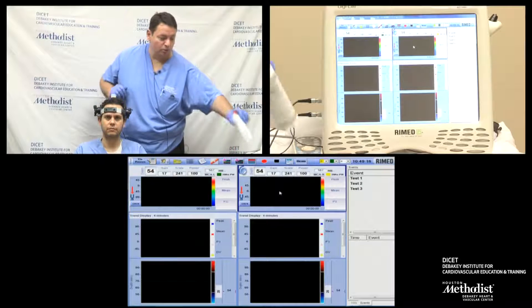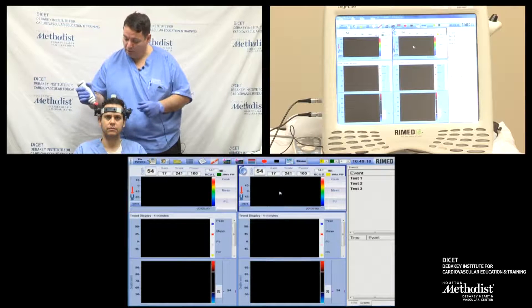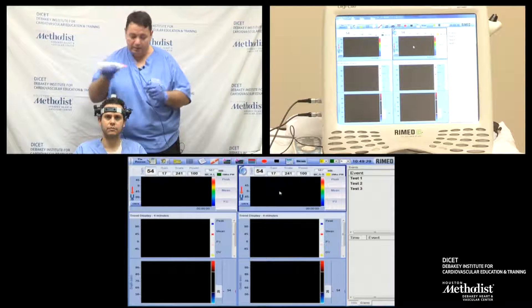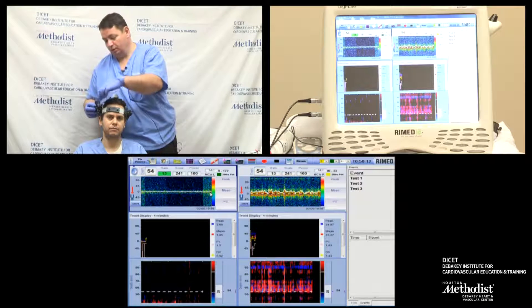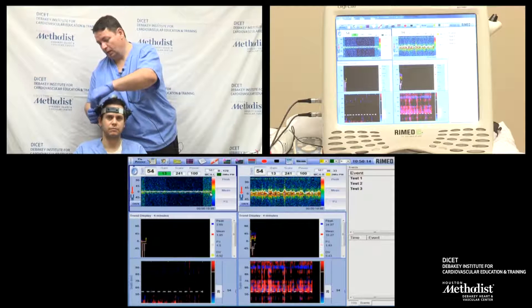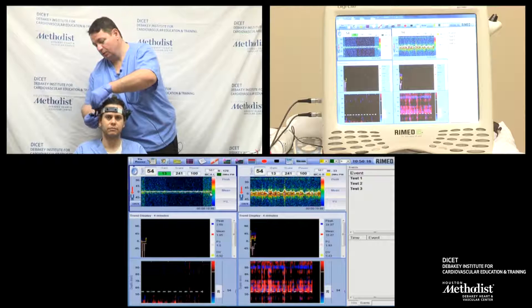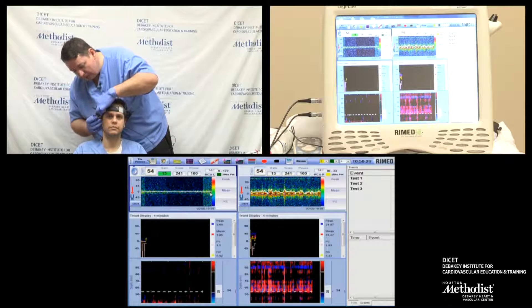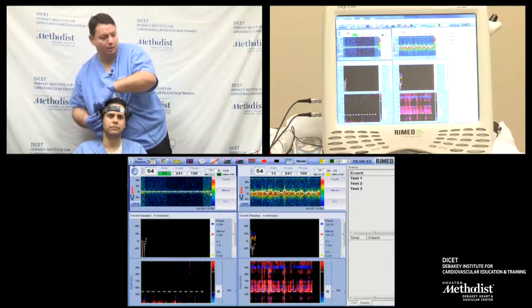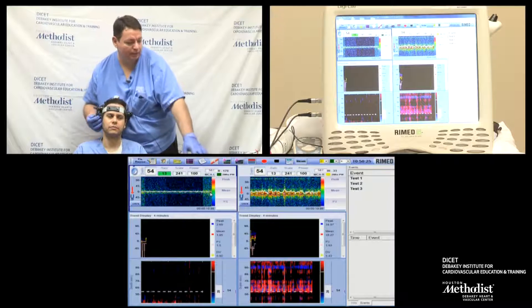After that, I'm going to place ultrasound gel on the probes and fix one at a time. After placing ultrasound gel on the probe and unlocking the probe signal, I'm going to fold it just in front of the ear, placing it angled anteriorly and up, and looking for the signal.